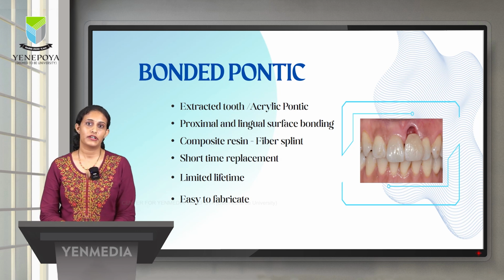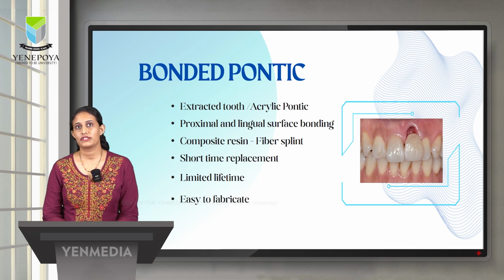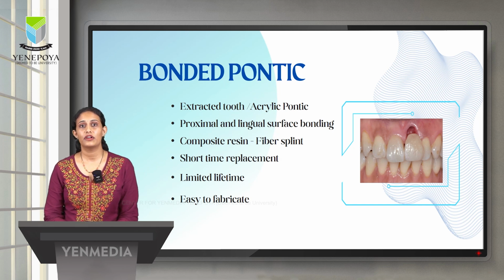It is a short-term replacement and has a limited lifetime, so you cannot use this as a definitive prosthesis, but you can use it as a temporary prosthesis. It is easy to fabricate, so you can give this even in implant cases where you have to submerge the implant and maintain that space for a long period of time till the implant heals.